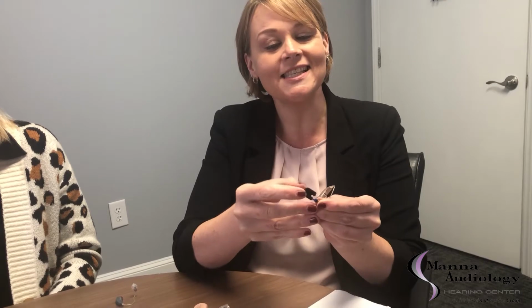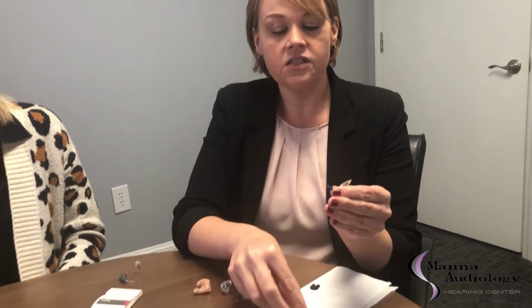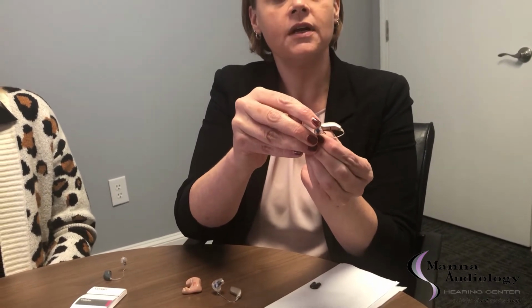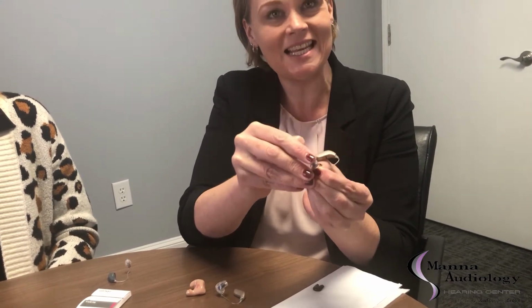So when you hear it snap, you're gonna pull that guy out and you're gonna take the replacement there and you're gonna pop it right into place. Again, you don't have to jam it in there. It's a pressure fit and you just gently put it in there. Now to put the rubber dome back on, you're gonna start at an angle, push that guy over, and I always like to make sure by pushing here down in the center to make sure that that's nice and snug, because you don't want that guy to come off in your ear.